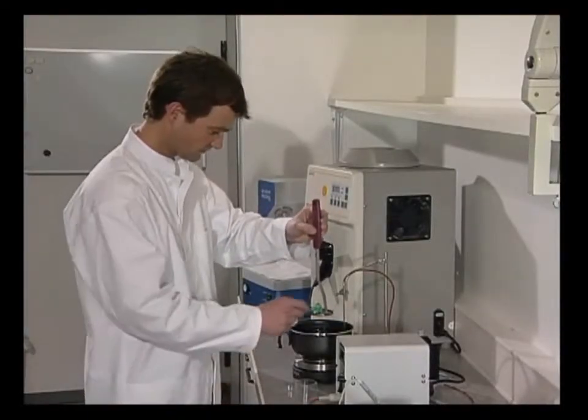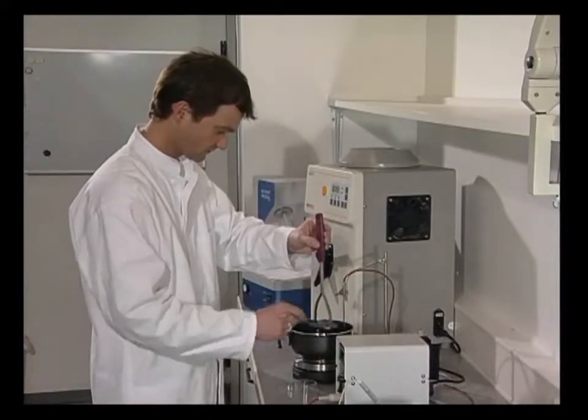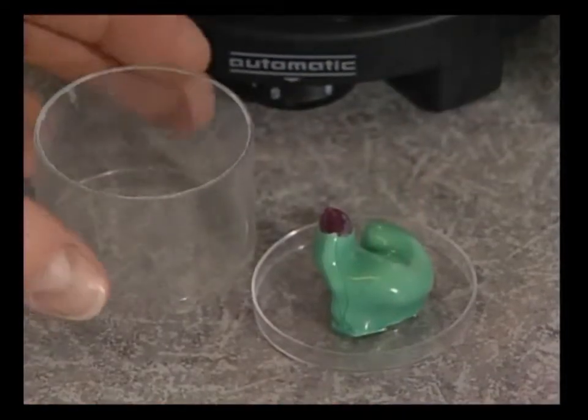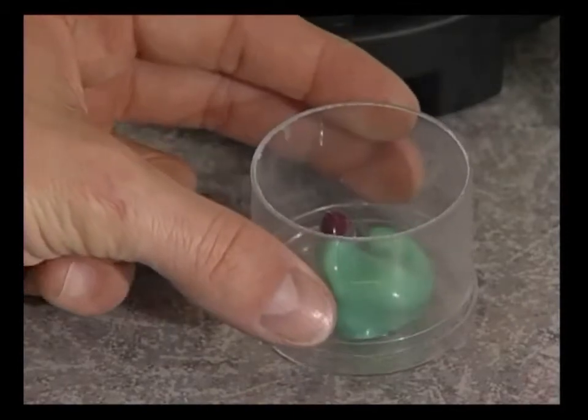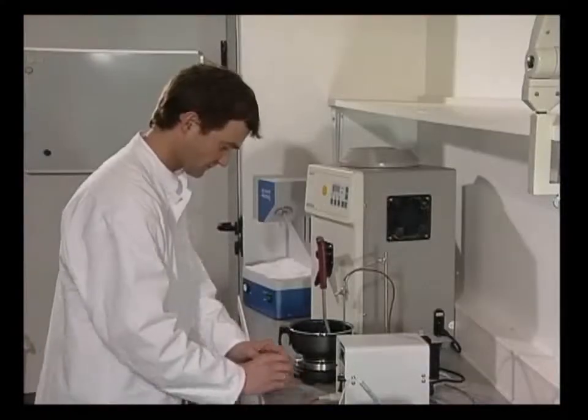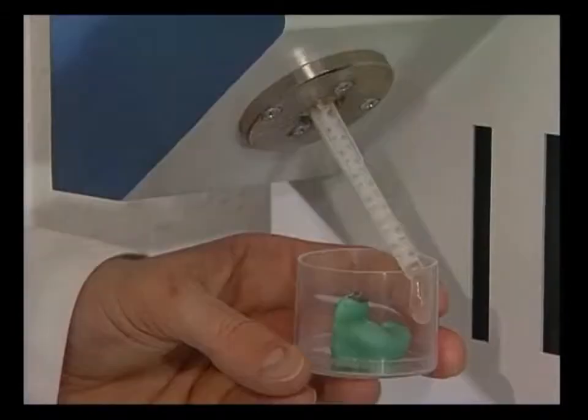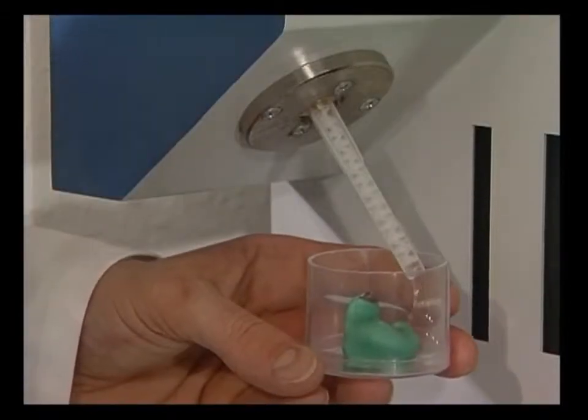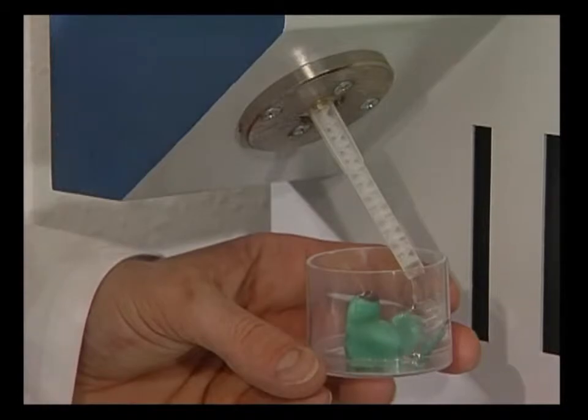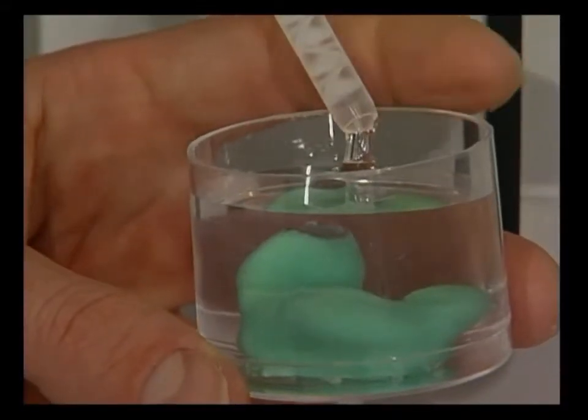After a brief cooling period, the impression is positioned in the middle of the bottom part of the investment form, and the ring form is inserted into the bottom. The investment form is held at a slight angle and filled until up to about 0.5 cm of the auditory canal are covered.